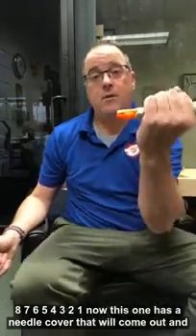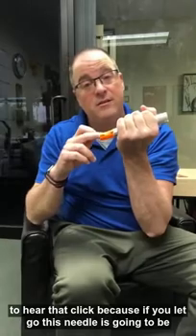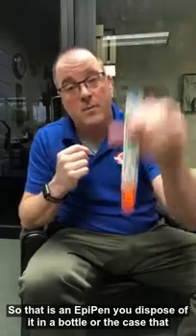Now this one has a needle cover that will come out and block the needle, so it's important that you hold it firmly in the leg once you hear that click. Because if you let go, this needle is going to be blocked and it's going to squirt the medicine all over the floor. So that is an Epipen. You dispose of it in a bottle or the case that you have, and it goes with them to the hospital.